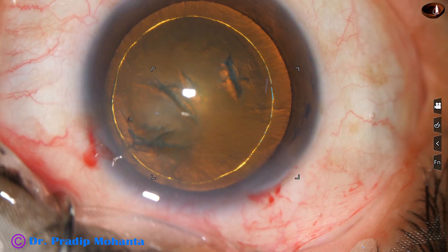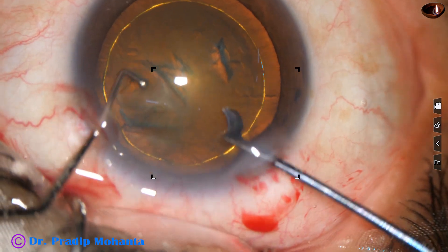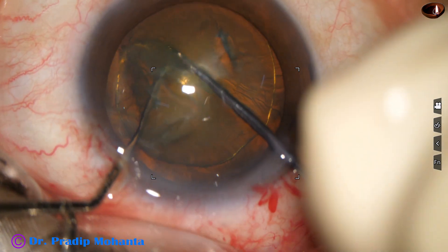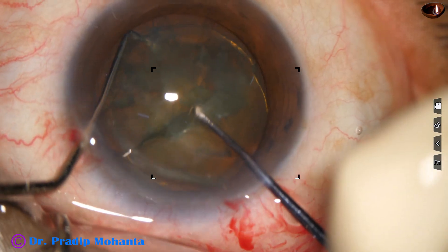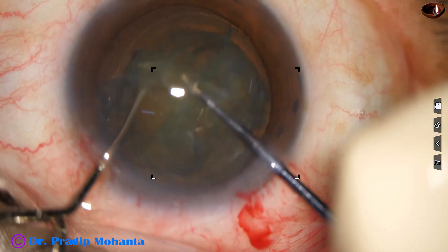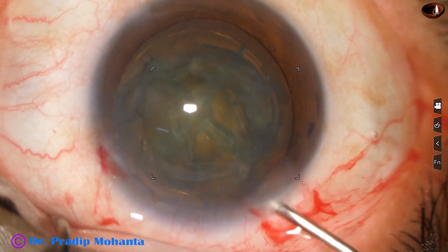Again some viscoelastic in the anterior chamber, and now I am going to divide this nucleus with the help of this pre-chopper. The pre-chopper goes in, the sustainer goes to the opposite equator, the two instruments come to each other and the nucleus is divided into two hemi-nuclei. One hemi-nucleus is subdivided into two pieces, rotate and divide the other hemi-nucleus into another two pieces. So we have got four pieces in a very short time.